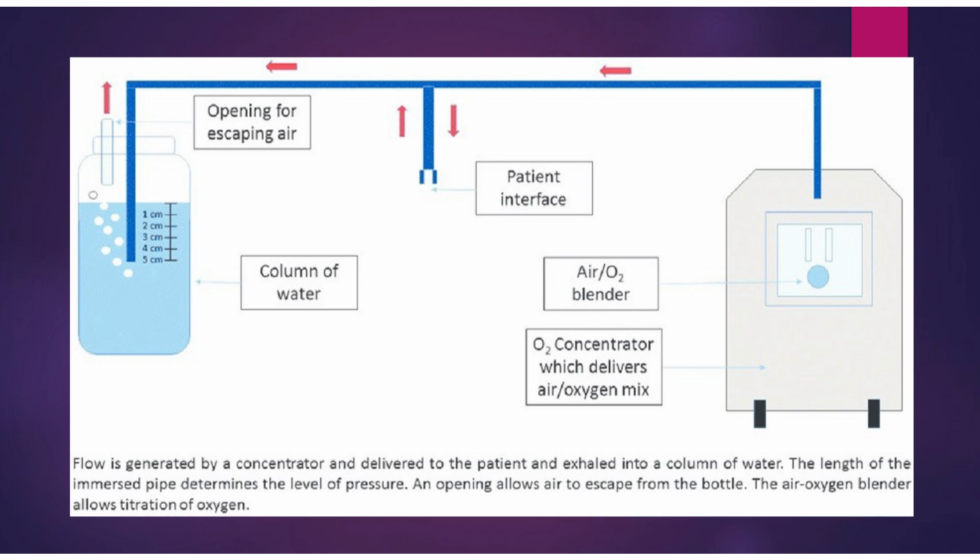We normally adjust by 1 to 2 centimeters, not a big jump, every hour or so. If you go back after an hour and your respiratory distress is still bad, more than 4 on the Downes or the Silverman-Anderson, you're going to increase your pressure to 7. If it's still bad an hour later, you'll increase up to 9, and vice versa. If it's reducing and the baby is happy, you reduce it down to 3, and then maybe down to 1, but probably you'll think about stopping.